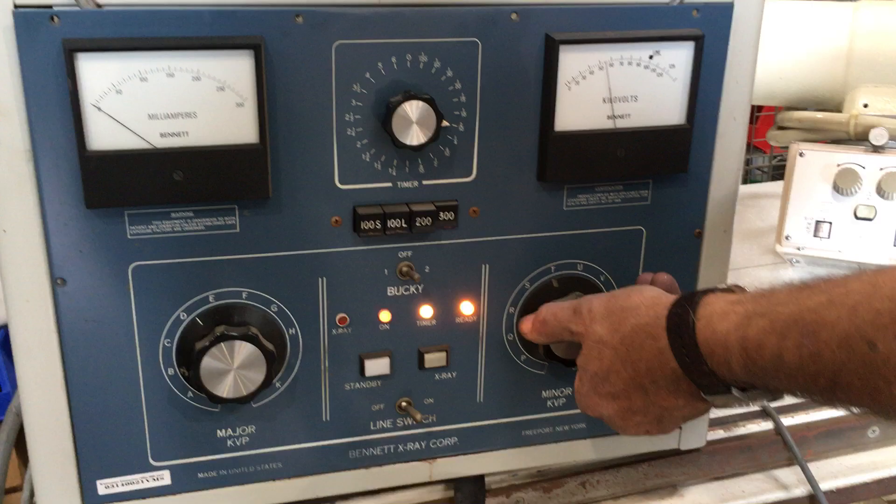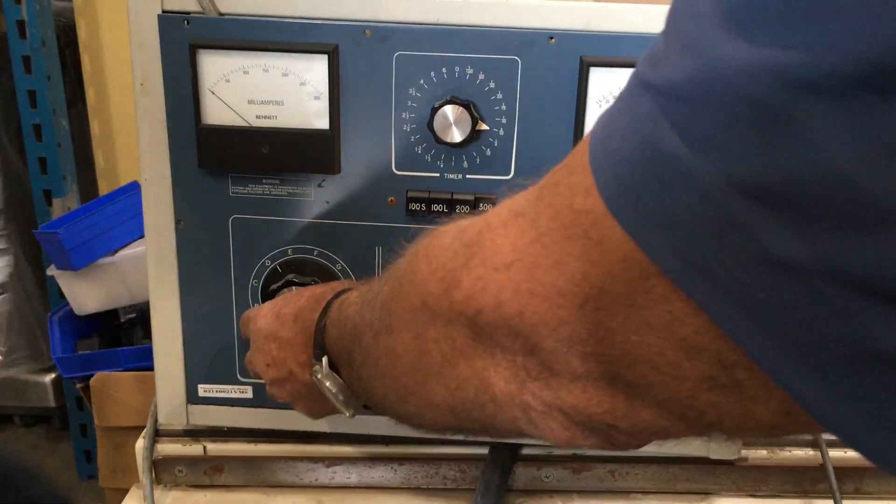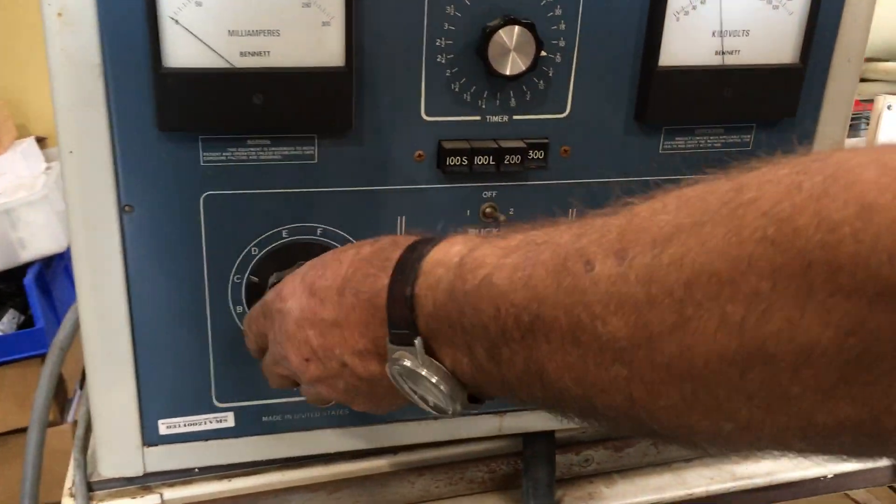Here's how you set your kilovolts. This is your major and this is your minor — that makes it go.